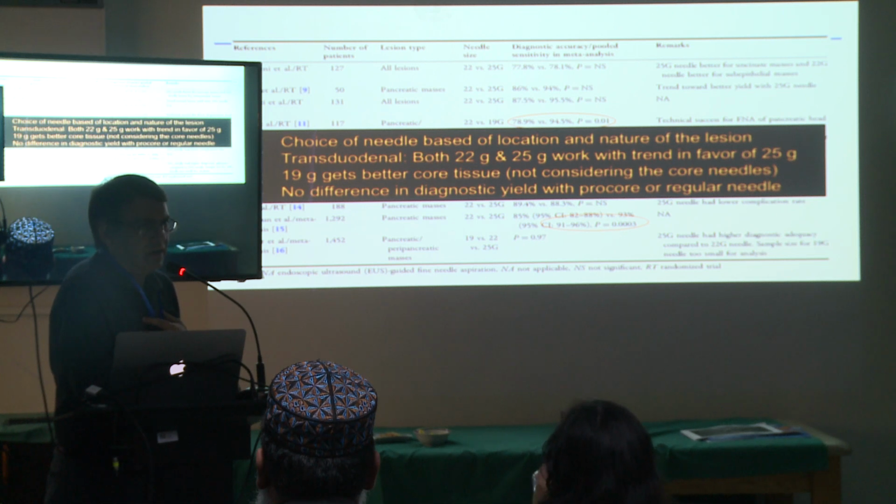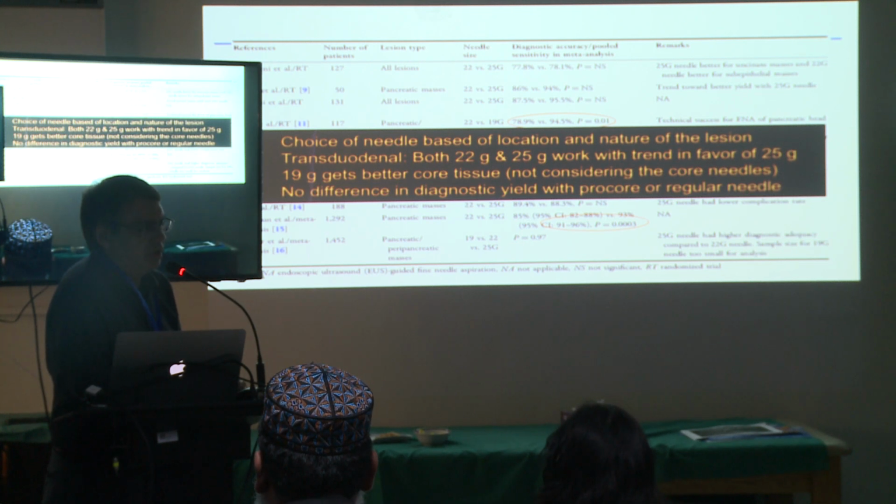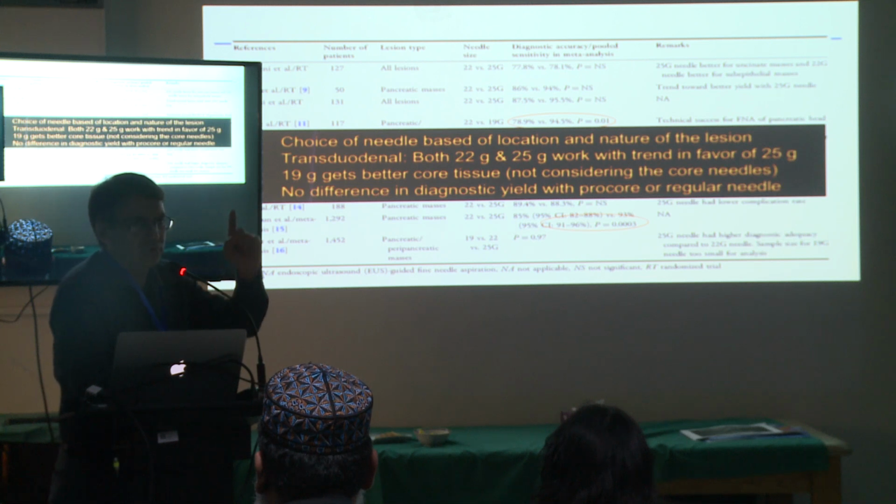my colleague Dr. Shaim Verdrajulu just uses a 22 gauge FNB needle. I sometimes diverge from that course based on the type of lesion and location of the lesion. If I'm going into the bile duct wall, I only use a 25 gauge needle. Yesterday, for the gallbladder suspected lesion, we used a 22 gauge, but I like 25 gauge for the gallbladder too, to avoid any bile leak. So when there is a risk of bile leak, I go with the 25 gauge. If it's a metastatic liver lesion, I go with the 25 gauge needle. And everywhere else, I'm using a 22 gauge FNB needle.